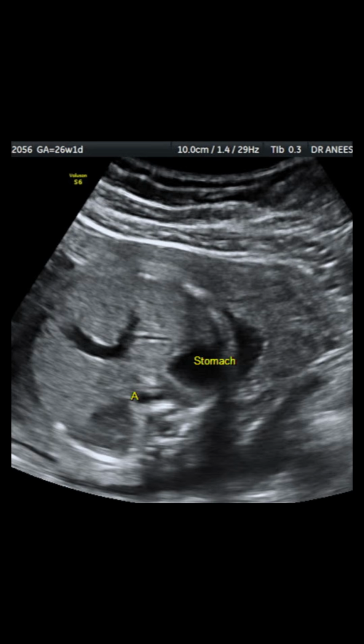This is a case of complete situs inversus, where the stomach is in the right hypochondrium. At just 1 month old, the baby underwent surgery for volvulus malrotation of gut and is doing well after the surgery.